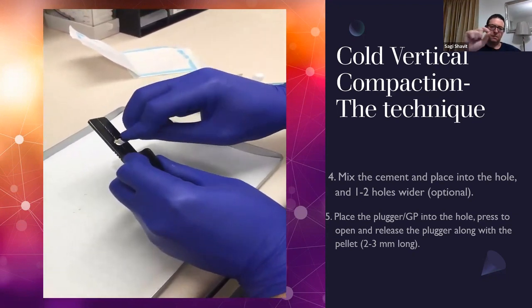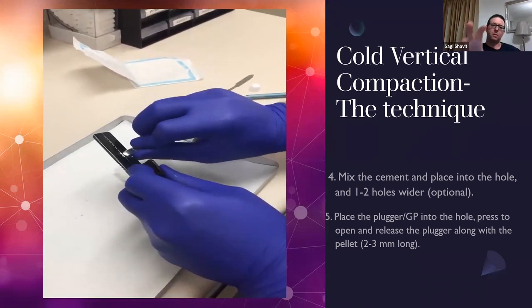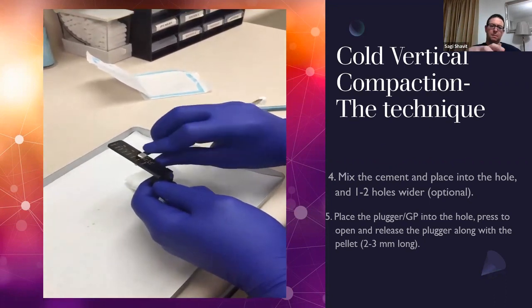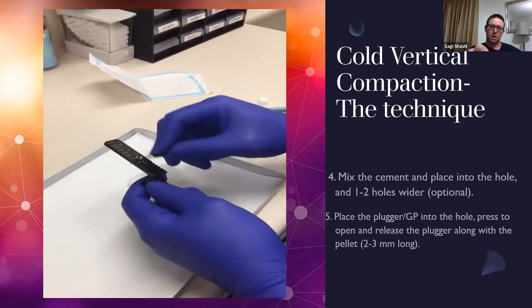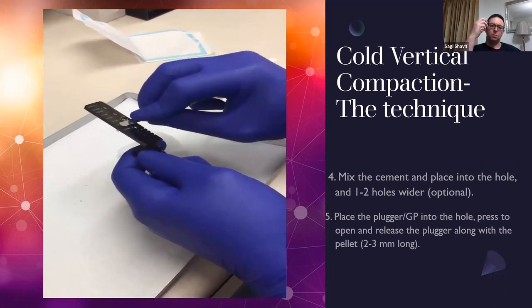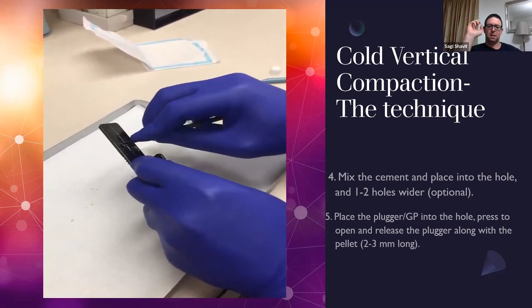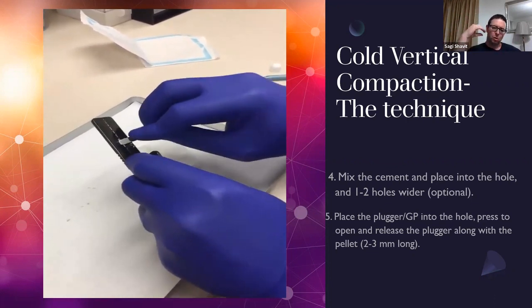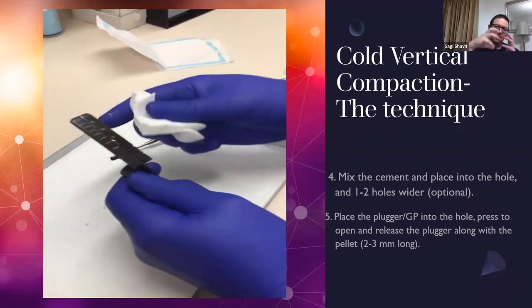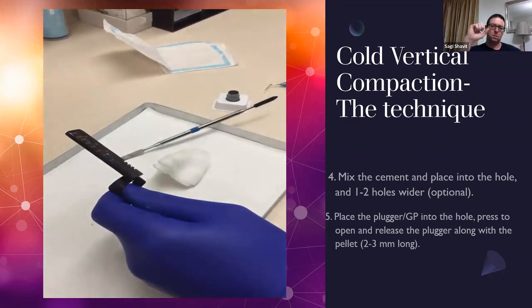You can fill them from both sides and have ready a sterile gauze, okay? No point in using any papers or anything like that, which are dirty. You've just cleaned the canals. You want to work as sterile as possible. So use, please, for this to wipe any excess and also compact. When you're wiping this way, you're actually even more compacting the material into the holes, okay?